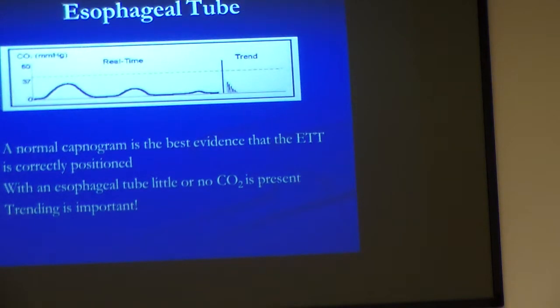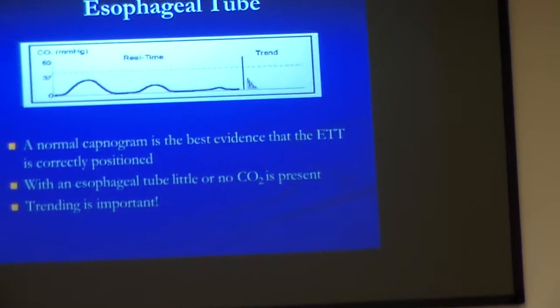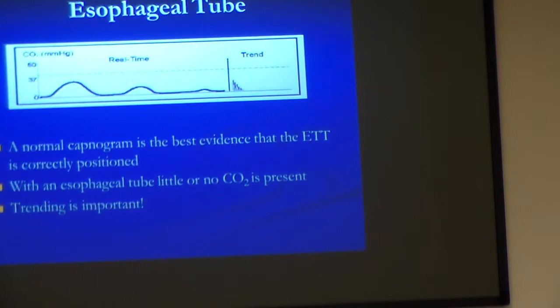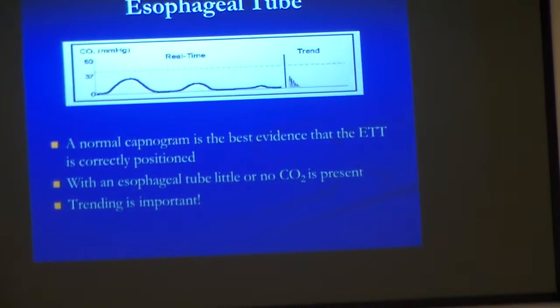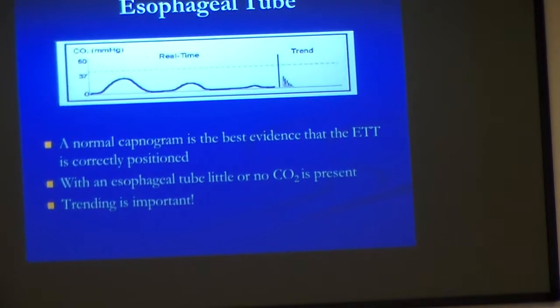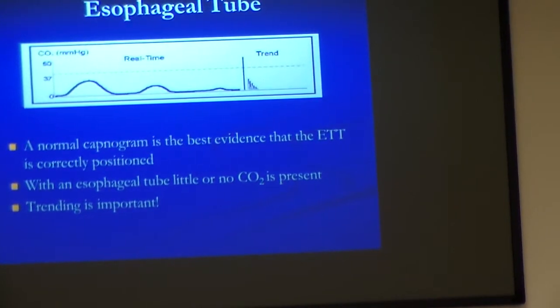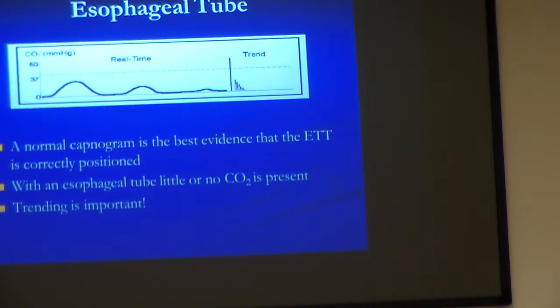Does our monitor show a trend if you haven't, say you just attach your end-tidal on a code, you know your tube's in, you're not paying a whole lot of attention to the numbers because you're giving meds, doing everything else. You know what it was when you first put it on, and then you get to the hospital and you see it. If you haven't pushed snapshot or anything like that, is there a trend that's going to show you what those numbers were, or do you have to pay attention only then? I have to look at it.